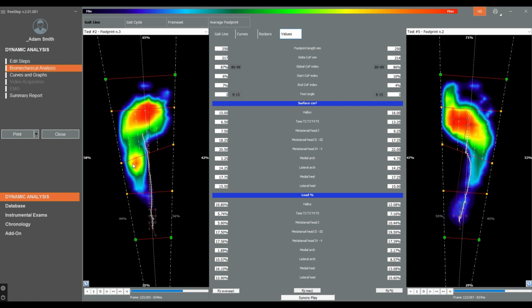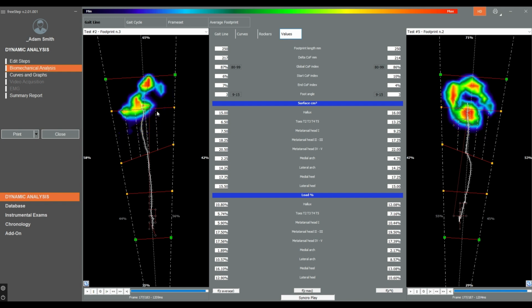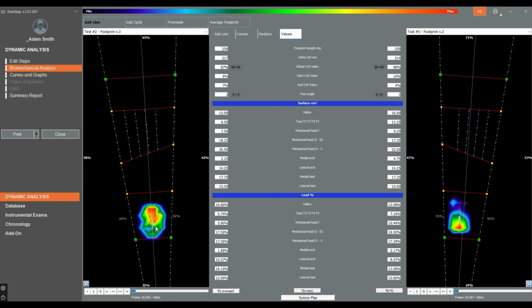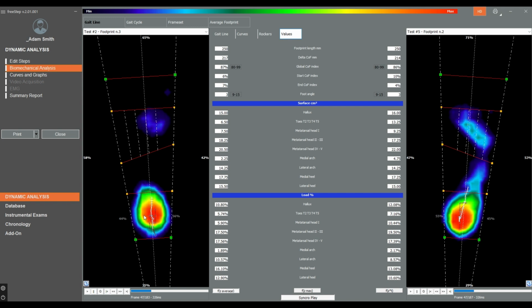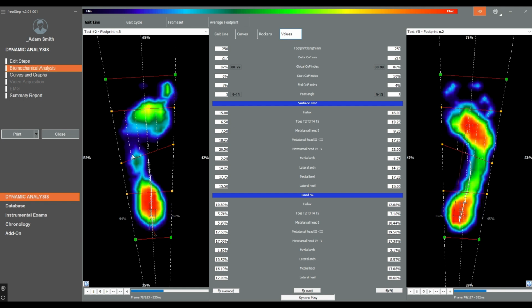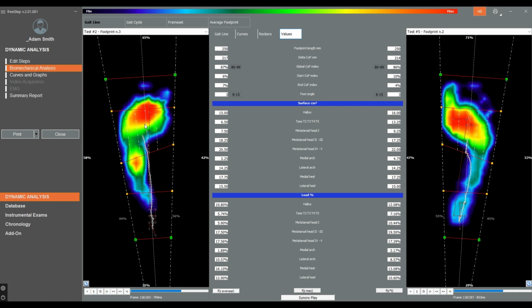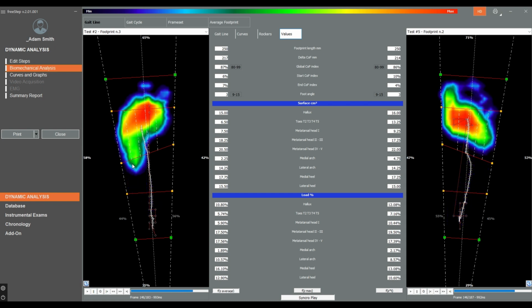That is actually an area of pain for him. Quite an even flat pad of pressure of red in the forefoot. But what's interesting to me is, well, first of all, there was an abnormal load in the rear foot. It wasn't a smooth circle. But there's red here appearing through the midfoot. But the whole time that the forefoot pressure is appearing, he's still applying pressure through that midfoot. That is abnormal, and that needs to be dealt with, particularly because he does get pain there.